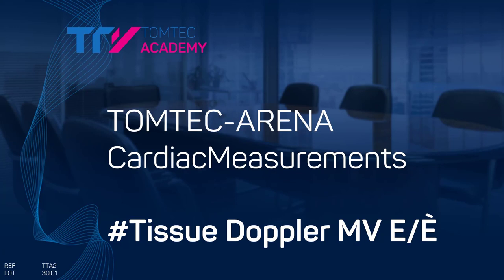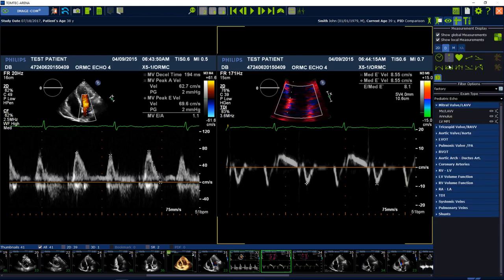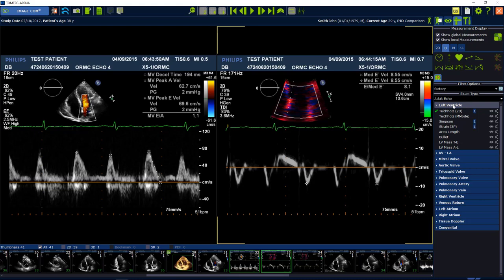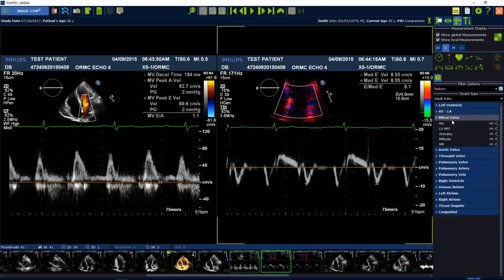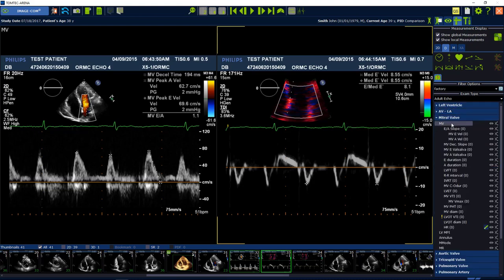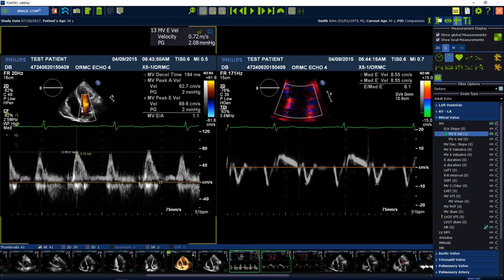To measure the E to E prime, move to the measurement tab on the top and select the exam type echo. Select the MitralValve package followed by the sub-item MV. Choose the MV E velocity, move into the image and measure the maximum E velocity.